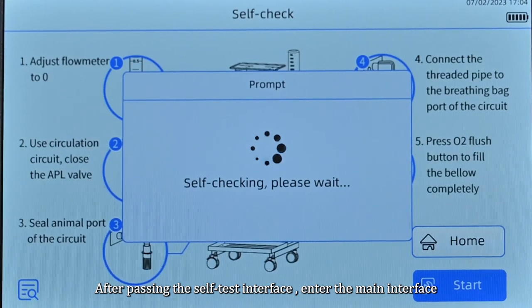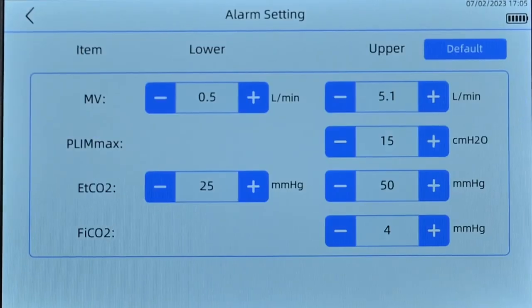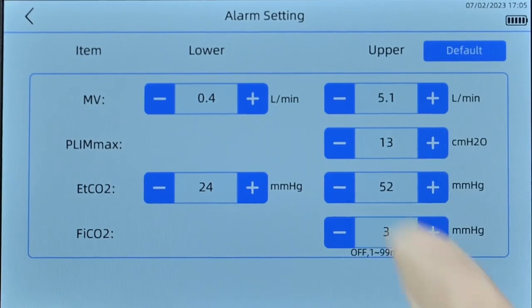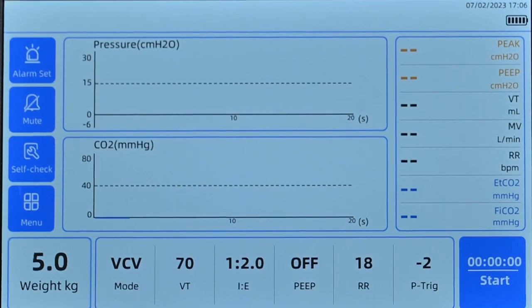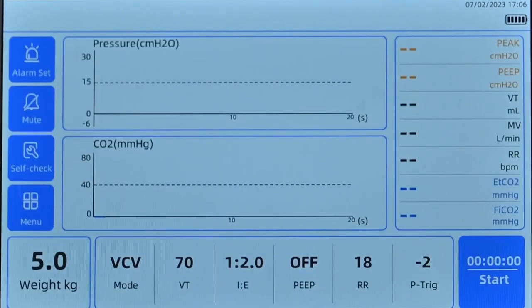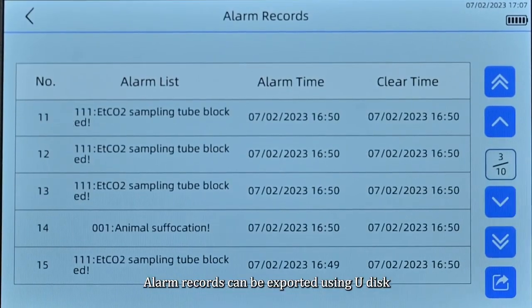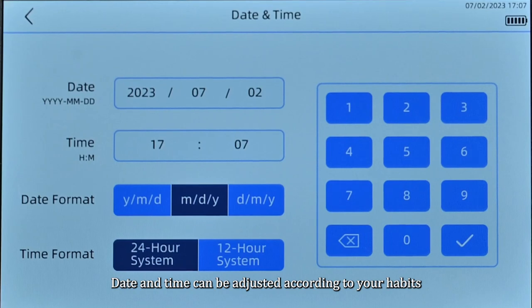After passing the self-test, the interface will enter the main interface. In alarm settings, you can adjust the alarm upper and lower limits or restore the default settings. The menu parameter list allows you to add custom parameters or directly call alarm records, which can be exported using a USB disk. Date and time can be adjusted according to your preferences.